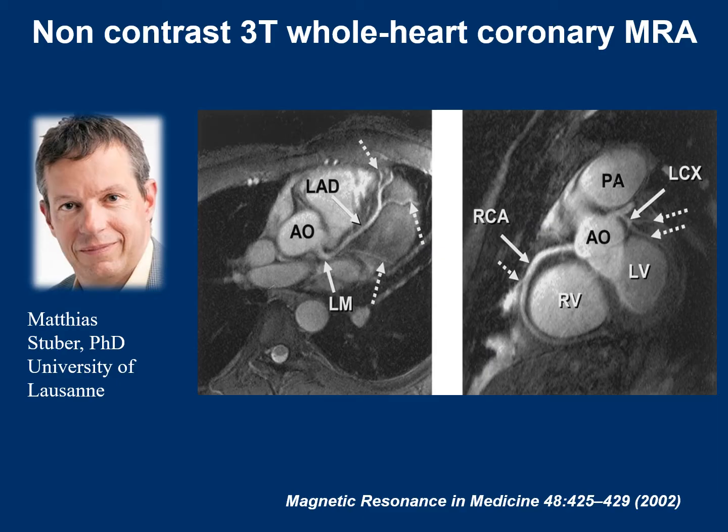Professor Matthias Stuber's group has been working on this field for many years. Here's the initial image of non-contrast whole-heart coronary MRA at 3T. Both LAD and RCA can be well delineated without any contrast agent.